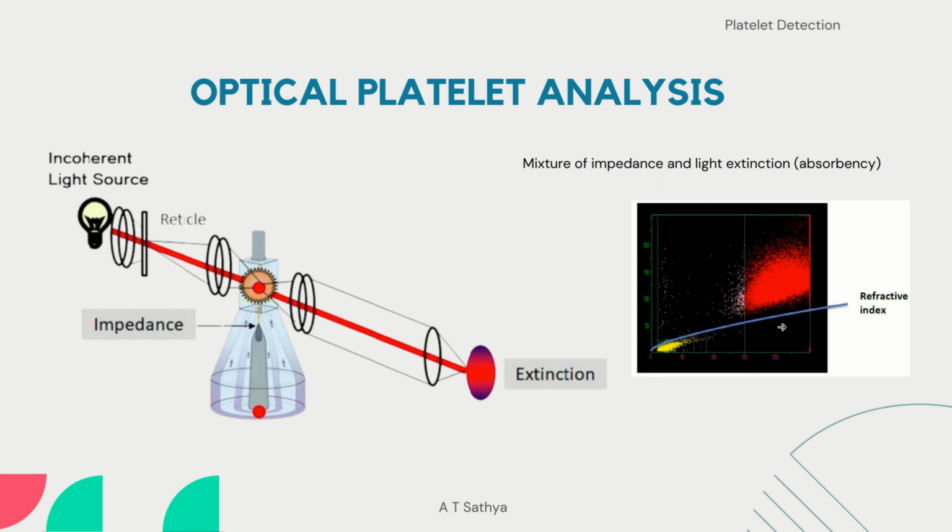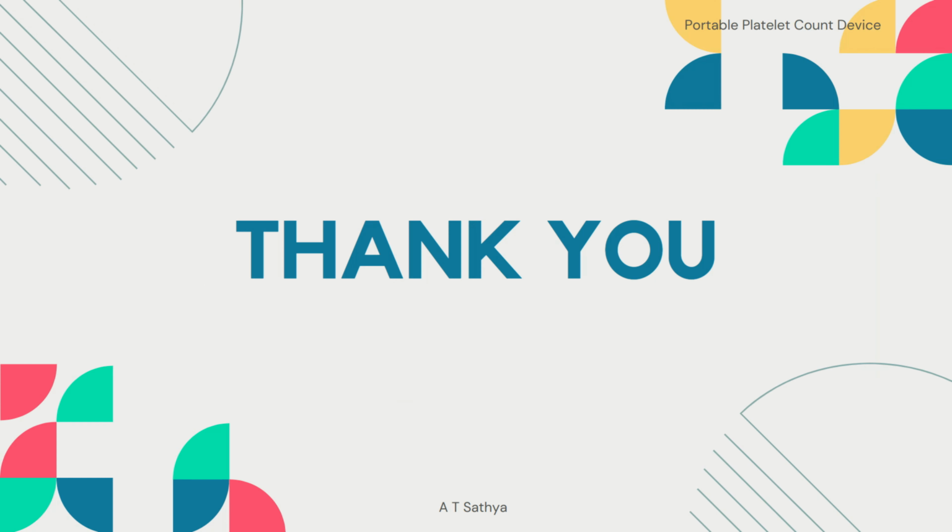Another method includes using a miniature microscope for detecting the platelets in blood. By using a tunable miniature microscope, we can analyze the WBCs, RBCs, and platelets at once too. So, in conclusion, platelet detection is a critical aspect of medical diagnosis. By leveraging the impedance and various other techniques, we can enhance patient care and outcomes.